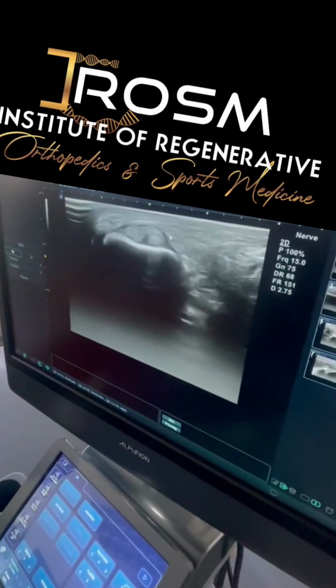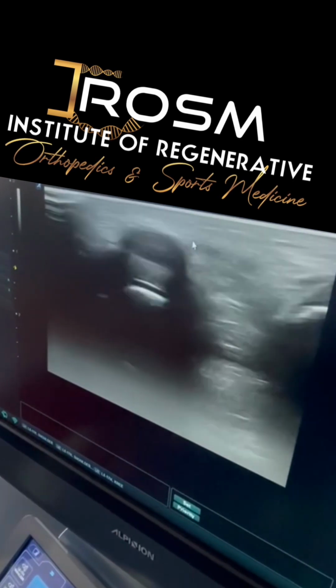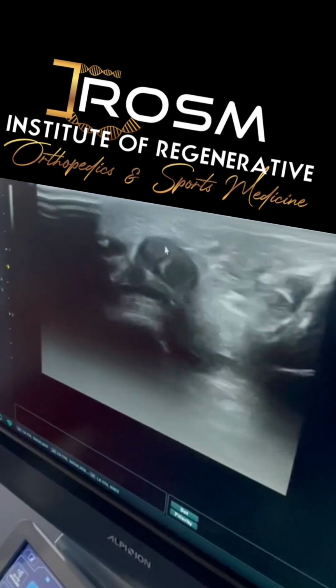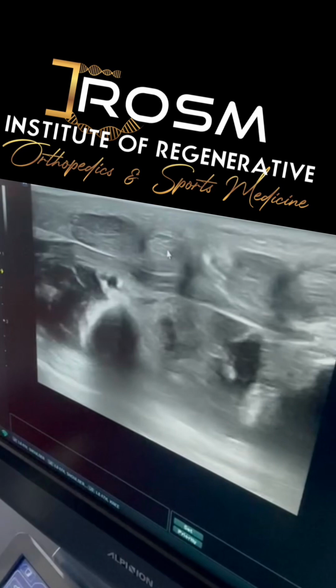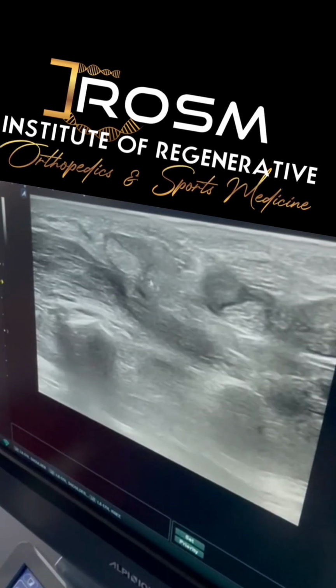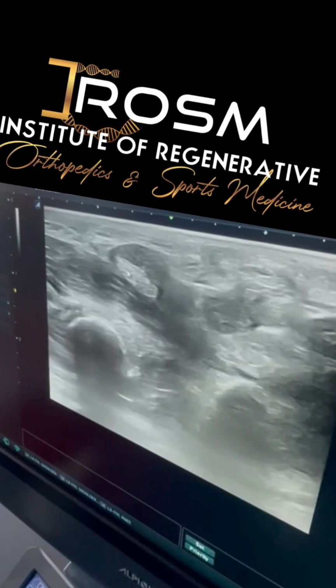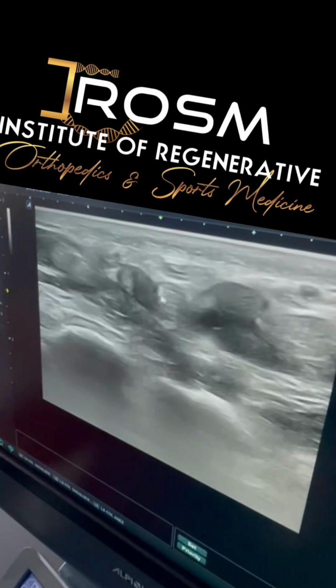When I'm able to get good tendon tissue there, and when I flex it, I see good tissue. So now I want you to keep an eye on it. I'm going to start to scan proximally now. Right there, you start to see the division of both tendons, 1 and 2 here. At this point, if I still flex it a little bit, we are able to see some motion. Keep an eye on here.